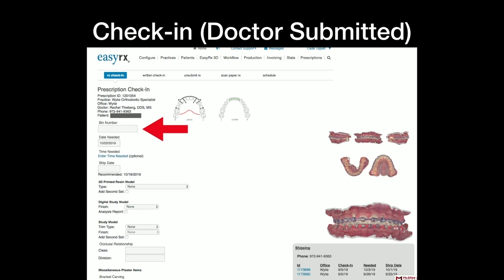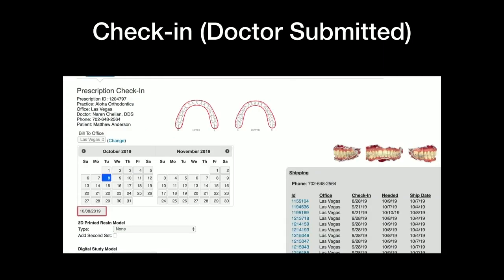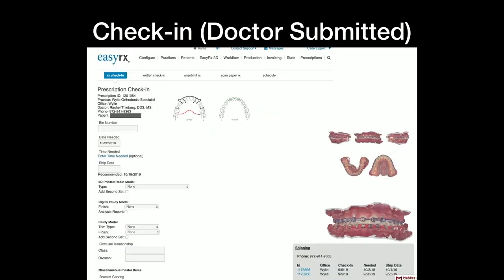And then, of course, you put the bin number in so that you can search. When you search for prescriptions, you can search for bin number, last name, doctor. It's a whole database. And then, of course, date needed. This is what the doctor asked for. Now, once you click on shipped, if I go back, you'll see ship date. So date needed, they asked for the 7th, and you need to ship it on the 6th, whatever your time schedule is to get it out. Oh, no. I pulled a Marlin.